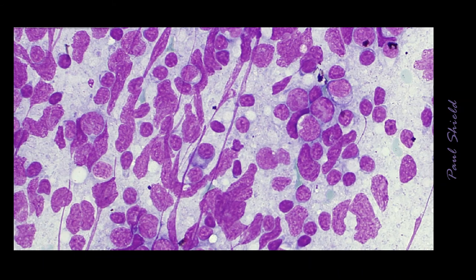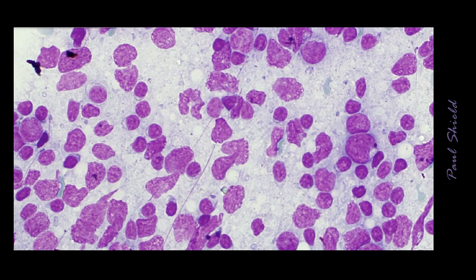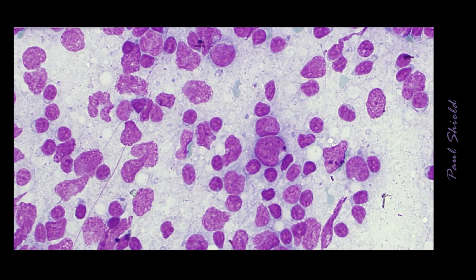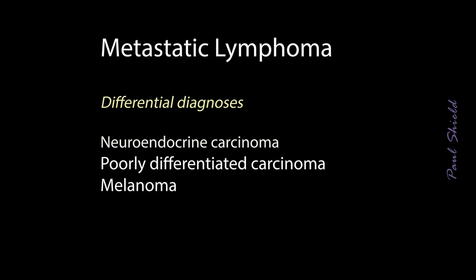There's a plasma cell there on the right hand side, but these guys here certainly seem to have that little rim of cytoplasm on them. There are little mature, probably lymphocytes there. It's often a matter of scouting around to find a cell or two that you are happy are definitely lymphoid. So that's high-grade lymphoma. Easy to make a diagnosis of malignancy, but much harder to type.